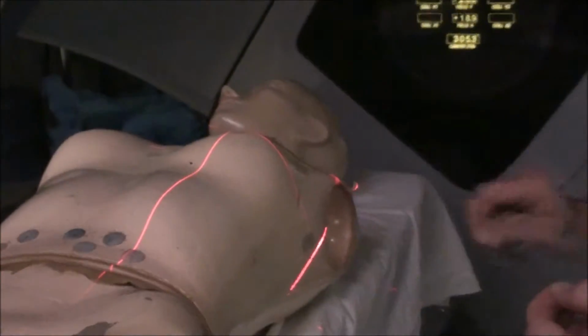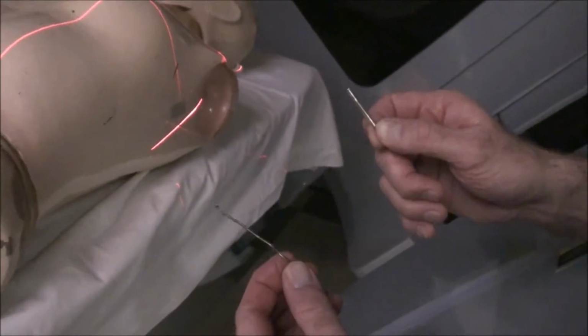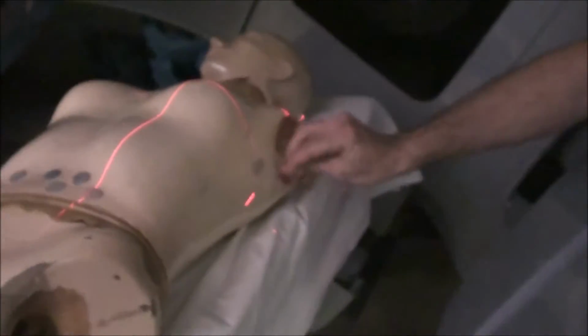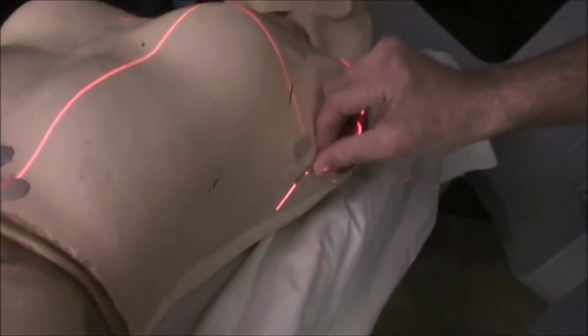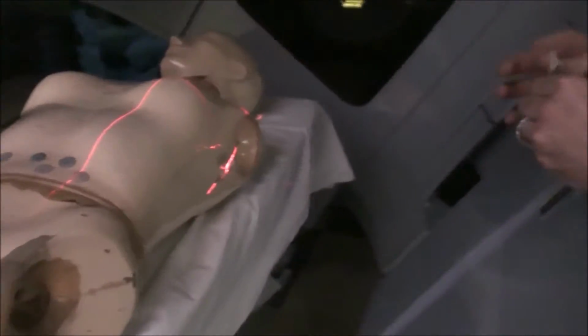What you will then do is you're going to have 2 wires, one fat and one skinny. Sometimes you can use twisted wire for the fat wire. You're going to put the fat wire on the lateral. I can't reach my tape right now, but you're going to put your fat wire on the lateral, and you're going to put your skinny wire on your medial. You're just going to lay it right across and do the same up here on the medial.